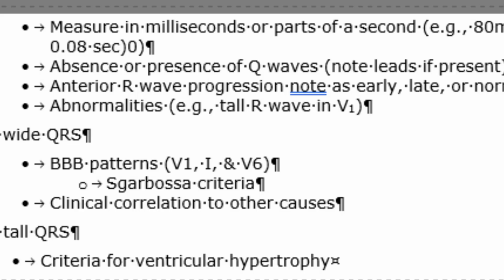On the other hand, should the QRS complex be wide, that is, greater than 0.12 seconds, it implies a conduction block in the ventricles, and the subsequent repolarization sequence makes examination of aspects such as Q waves, QRS amplitude, R wave progression, and even ST segment elevation or depression relatively ineffective.